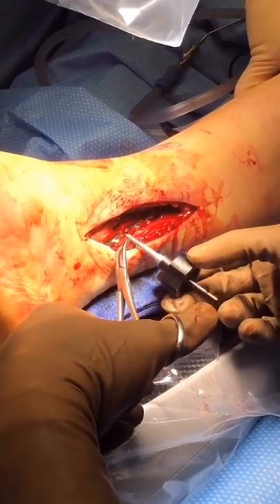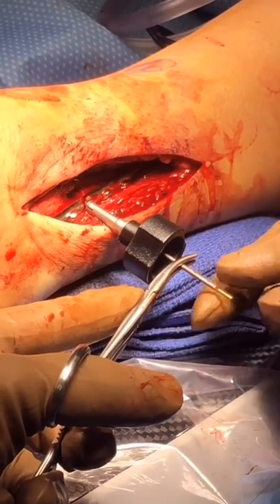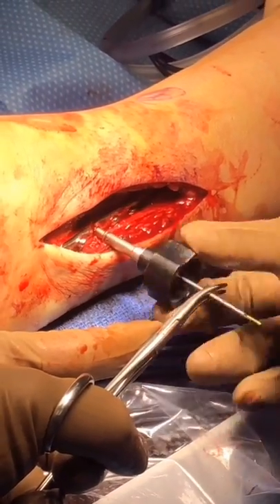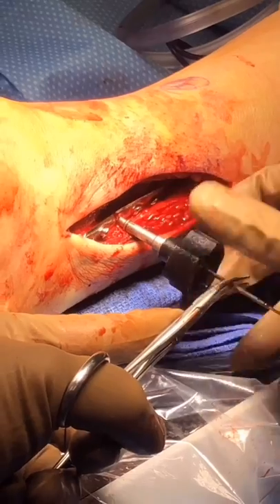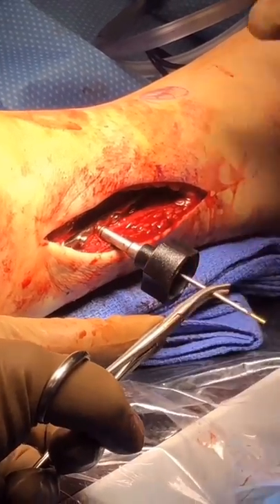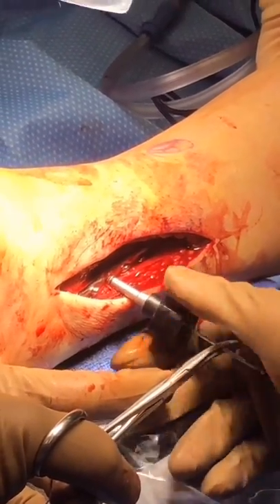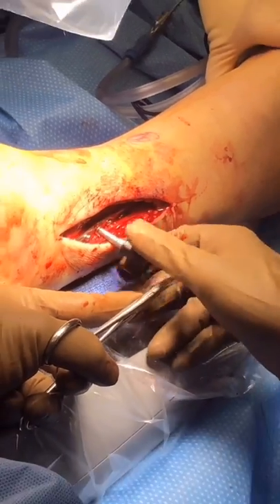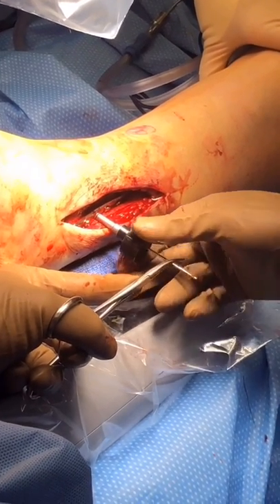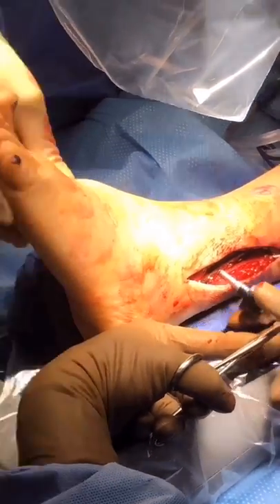Subsequently, a hemostat is used to grab the guide tube and pull laterally. This engages the threads of the fibular button with the Fibulink. Clockwise rotation tightens the construct and counterclockwise rotation will loosen the construct. This is important as it allows the surgeon to dial in the appropriate tension of the device to reduce the syndesmosis anatomically without over-tightening.